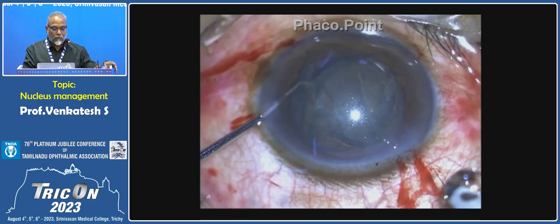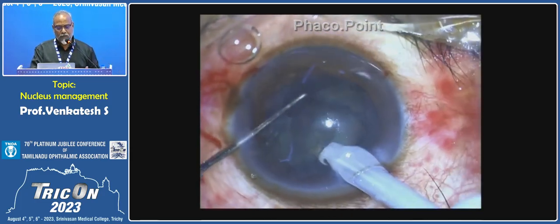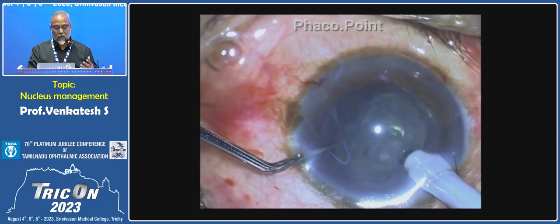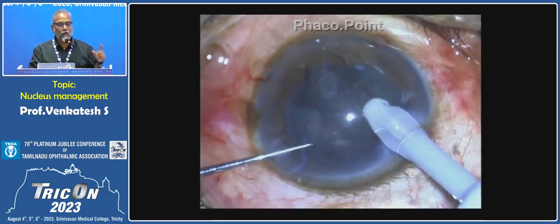Once this happens, visco is used and a second instrument is kept on the side. Using a very low phaco power of just 20% and pretty high vacuum of 250 to 300 millimeters of mercury, the nucleus can just be gulped down. Or you can use your epinucleus setting. Now, what is the flaw with this technique is that you have to go for a larger rexis.